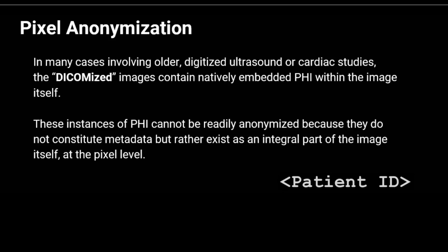Pixel anonymization, we touched on this a little bit earlier. As Florent talked about, you might have a modality that burns in PHI directly into the JPEG. So a DICOM object is basically a JPEG image which has a wrapper, a DICOM header with metadata at the top. And so it's easy to work with that header data, but at the pixel level, we have to think about how, if it's burned in, like if you took a picture of PHI, you can't edit that using the header, right?